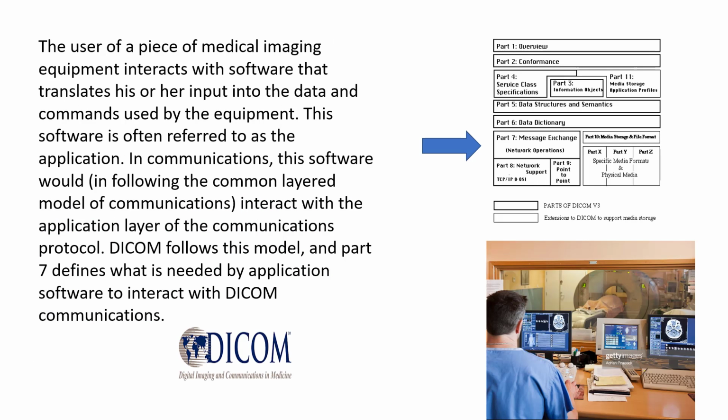The user of a piece of medical equipment interacts with the software that translates his or her input into the data and commands used by the equipment. In communication, this software would interact with the application layer of the communications protocol.